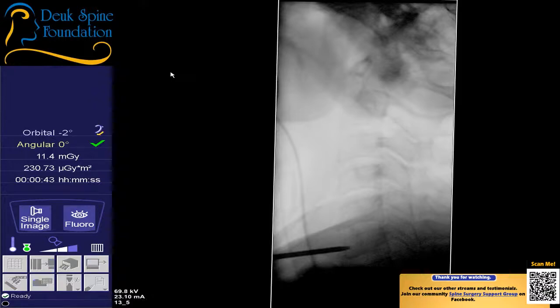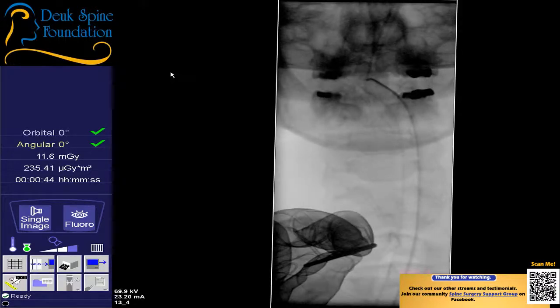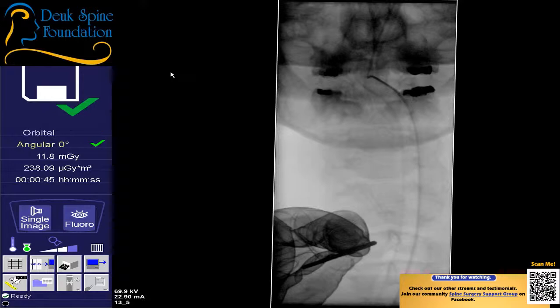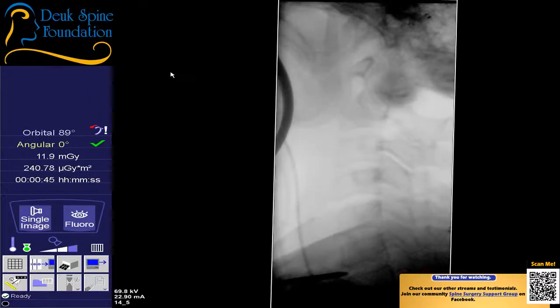Shot. Okay, AP. Almost done. AP, give me a lateral. I feel the disc. Yeah, I'm on the disc. 2, 3, 4, 5, 6, 7. I just need to get the AP one more time cleaned up. Everybody stay where you are, Coker.